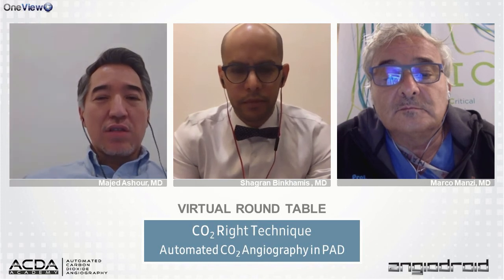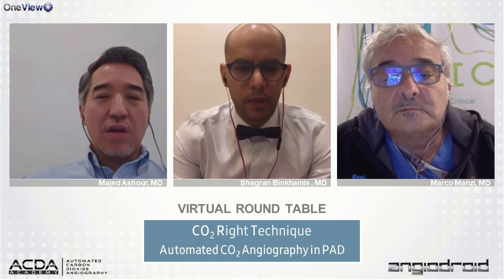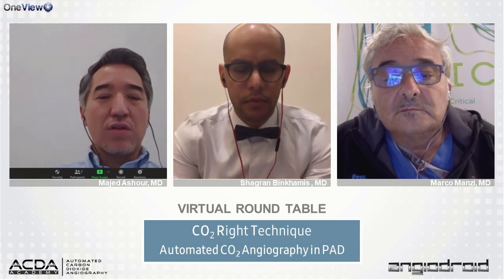For example, we started using it some time ago to train the technologists in doing venography in patients who are going to go for AV fistula. So before they go for their fistula, we do the central peripheral venography actually using CO2. It's a very good tool. You see all of this is beautiful.